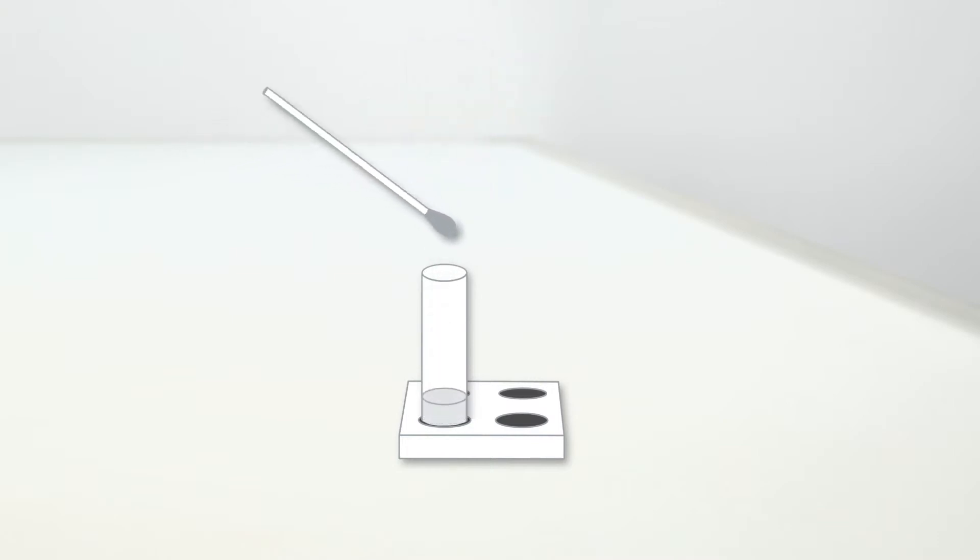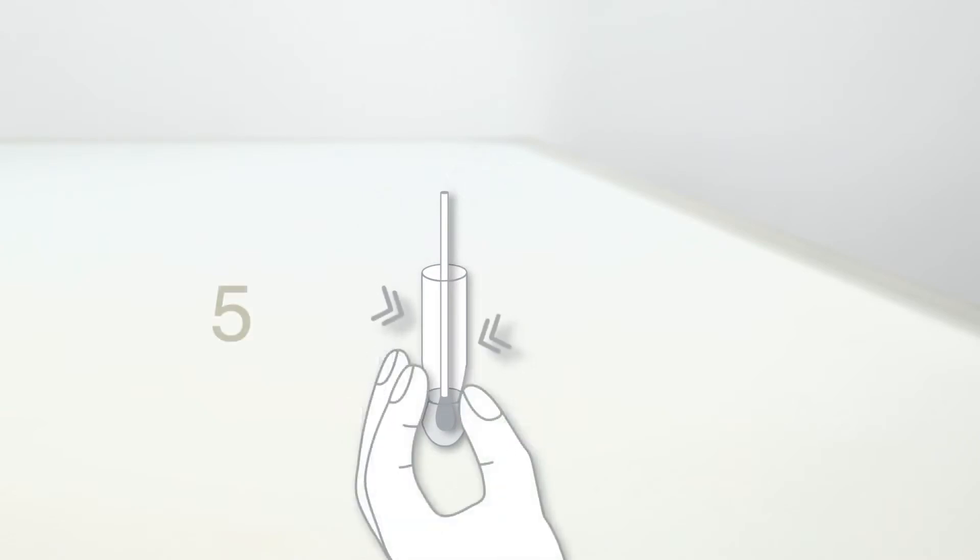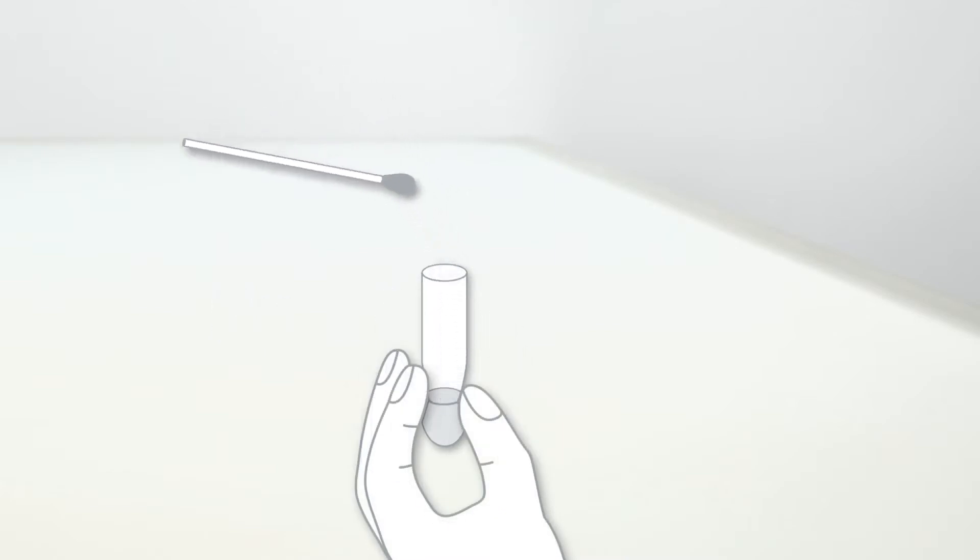Insert the swab with the collected specimen into the tube. Swirl the swab and squeeze it by compressing the swab and extraction tube five times. When removing the swab, squeeze out as much liquid as possible.